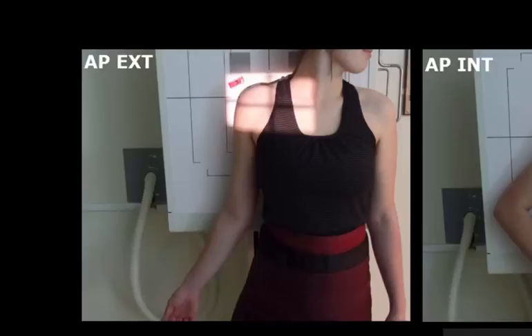You will want to collimate to include the shoulder joint and the sternoclavicular joint for most of the radiologist's preferences. Here, you want to ensure that the internal part of your light field is covering the area near the jugular notch and the exterior or outer portion just the edge of your soft tissue. Make sure you properly place your marker in an area that won't obscure the anatomy.